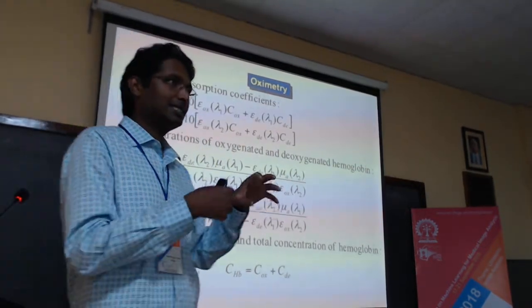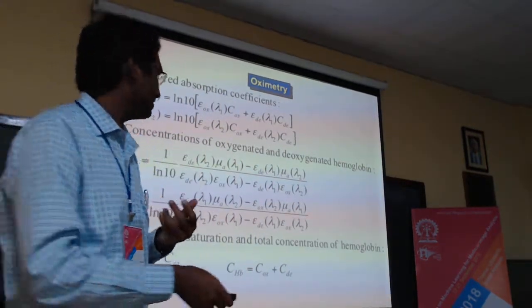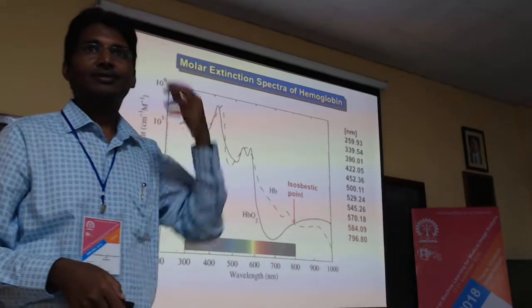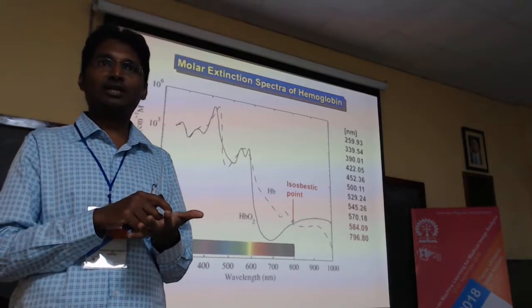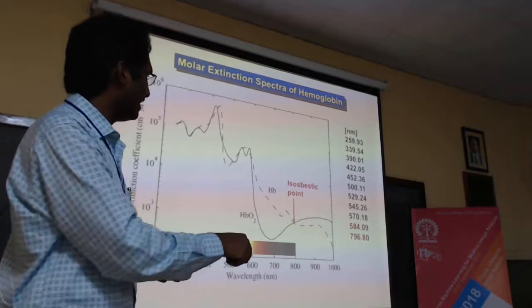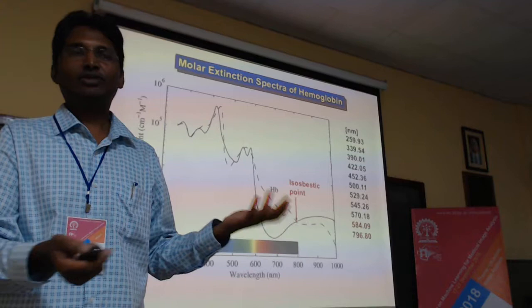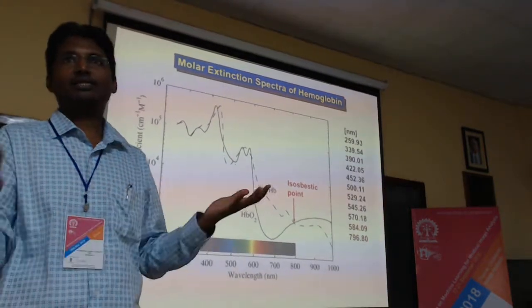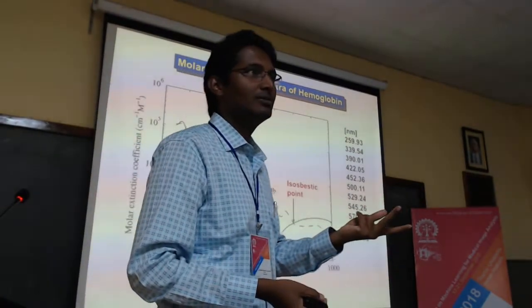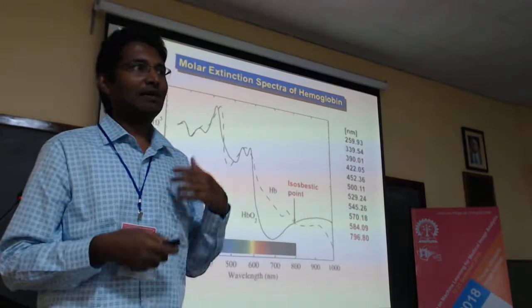Essentially, that clip is nothing but two laser sources. It distinguishes between HbR and HbO2. It's just the HbO2 signal divided by the whole signal coming from HbR plus HbO2. So it gets one laser signal at 796, another at some other wavelength which is sensitive to the HbO2, and then just divides by the whole signal. It's a simple laser with two wavelengths, giving you this oxygenation.